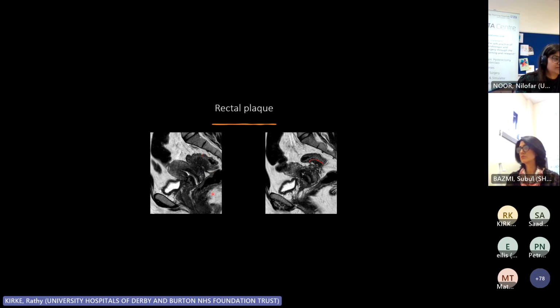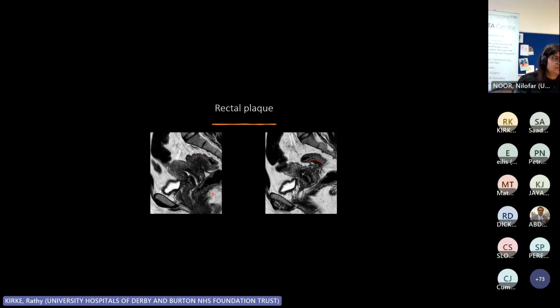If we see something like that, we do know that this is going to need our colorectal surgeons to be involved when this patient has her surgery. Again, there's lots of pelvic adhesions, everything's sort of stuck down. You can't really see this with ultrasound. You can tell that things are stuck down with ultrasound, and you can tell that there are adhesions. But what our colleagues like to know is how deep these plaques are going into the wall.